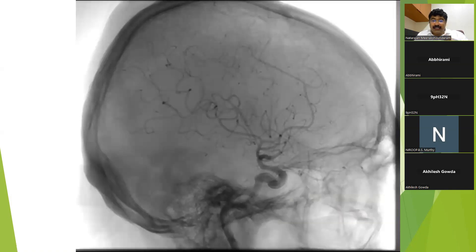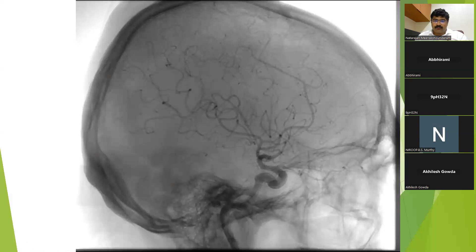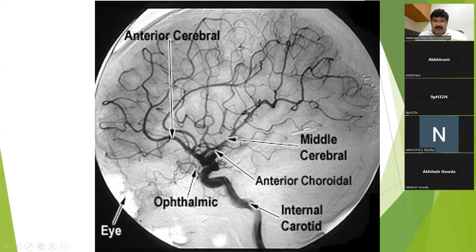Then is the lateral projection — the lateral ICA projection, seeing it from the lateral. After removing the skull, this is the ICA which bifurcates into the ACA and the MCA. This is the ophthalmic artery, and this is the posterior communicating artery.